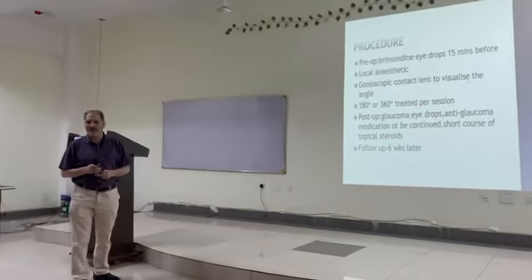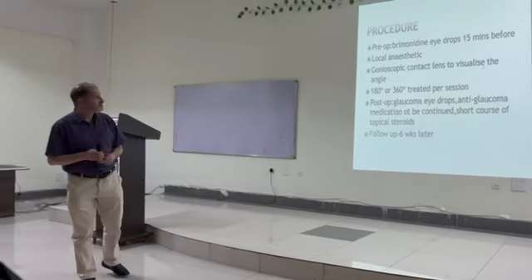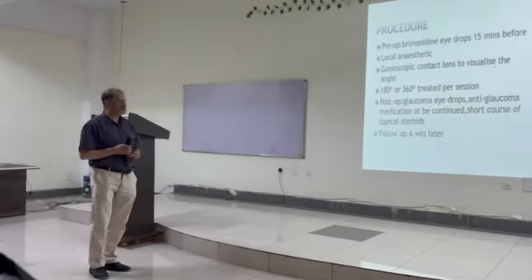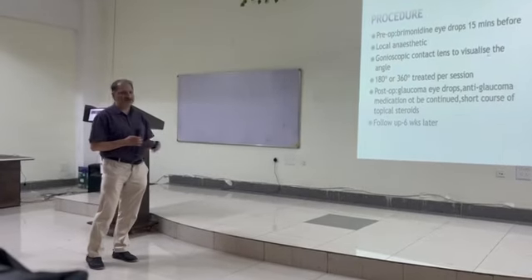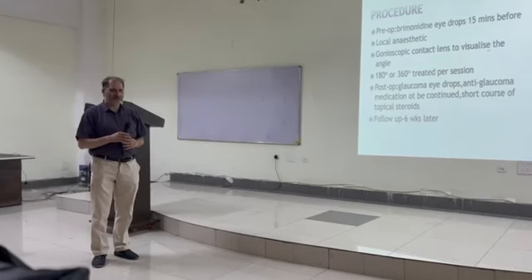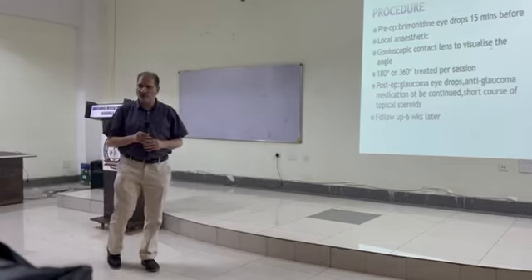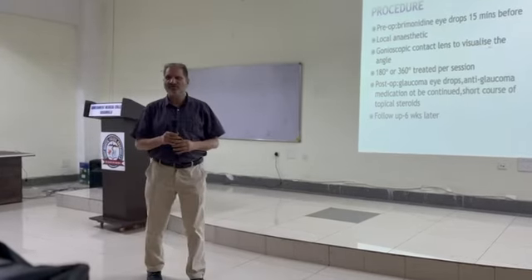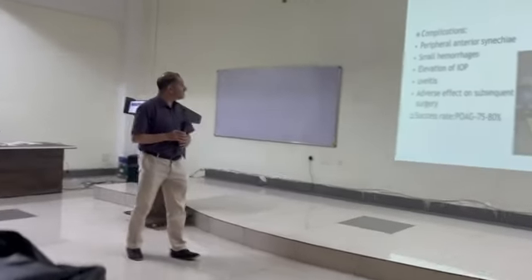The procedure is simple. We put a short acting anti-glaucoma drop. Per session, yes, sir. Then we go ahead, and after the procedure we put the patient on steroids. Correct. Next.